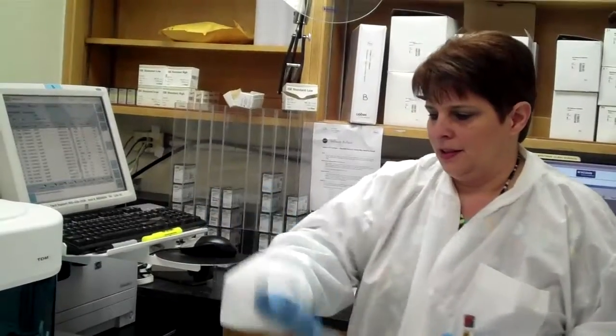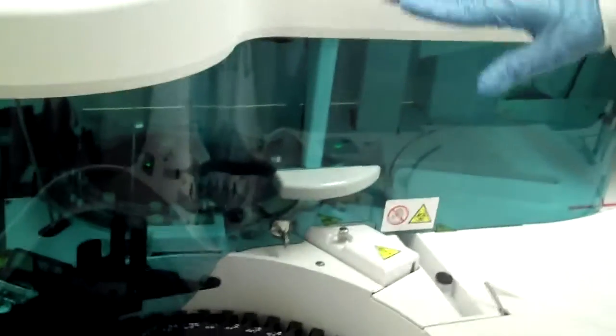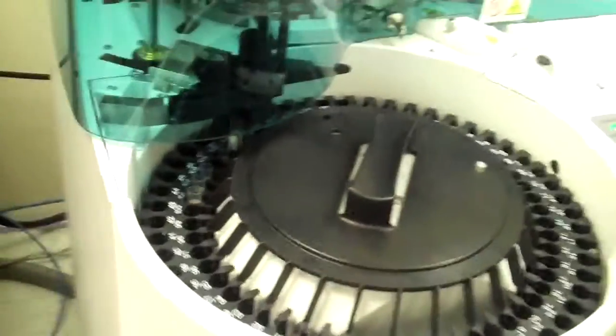All together, you load your specimen here, your reagents are going to be hidden back in here. Back in here is a whole wheel of little cuvettes and a massive amount of probes and moving parts. What they'll do is they'll come forward, everything's barcoded, it knows where everything is.